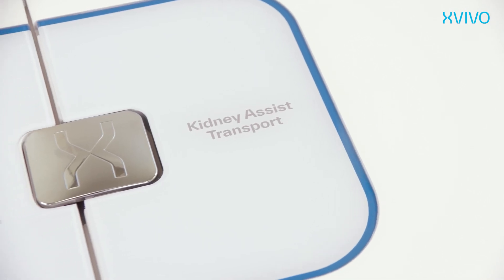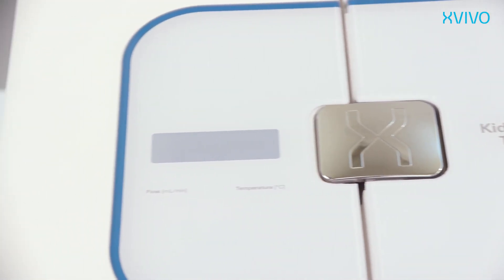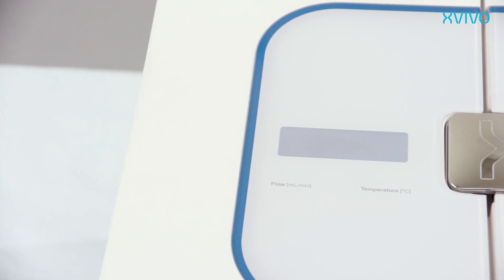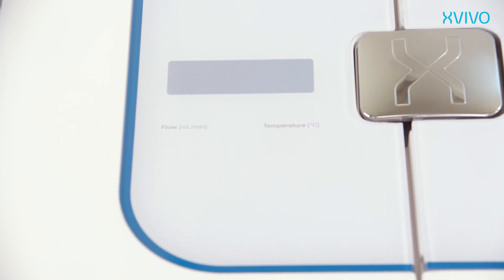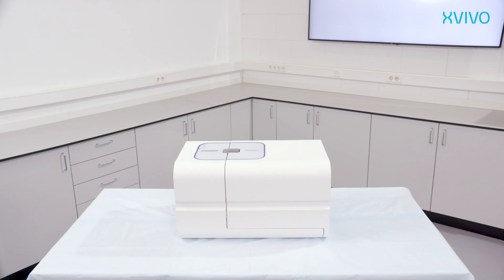At the top of the Kidney Assist Transport is the area with controls and display. The display guides you through the setup procedure. The keys can be used to confirm and adjust settings. During setup and perfusion the display will also provide actual information like perfusion parameters such as flow, pressure, temperature, and resistance.